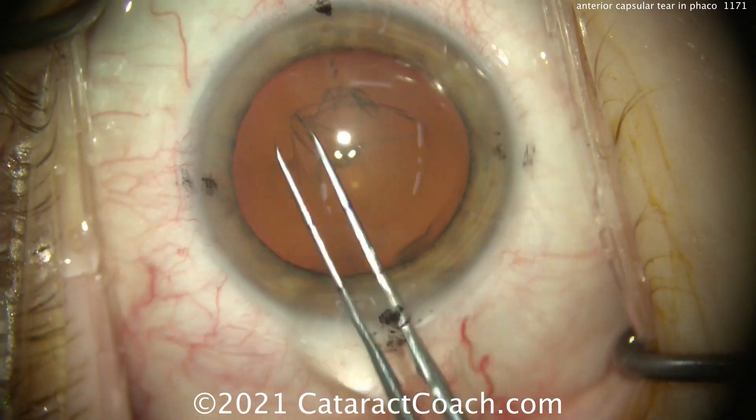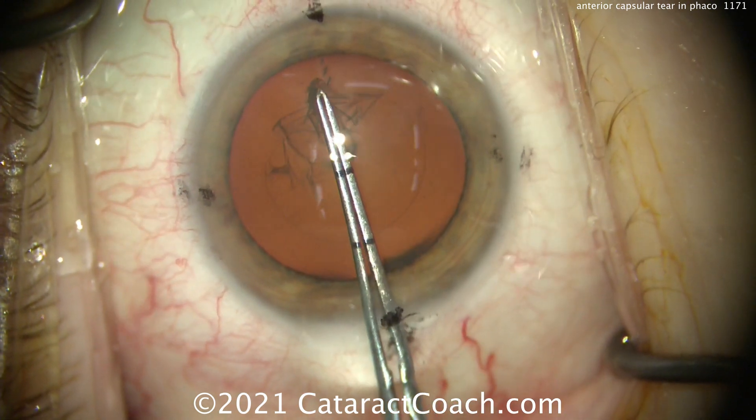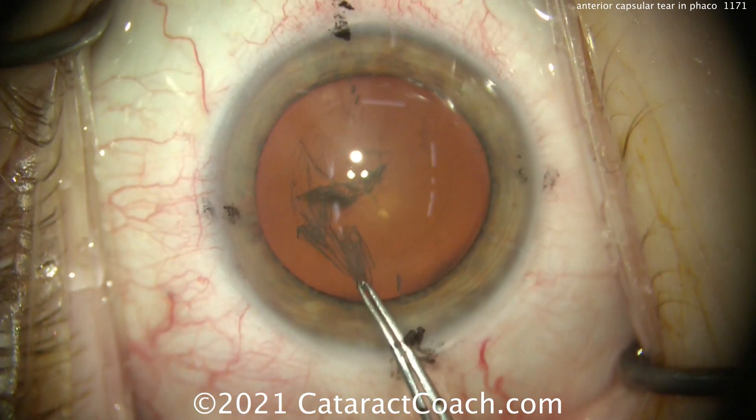You certainly want to try to get a beautiful capsulorhexis like we're doing here. We're going to end up with a very well-centered, perfectly round, intact, 5mm capsulorhexis. There's the rhexis — it looks great.